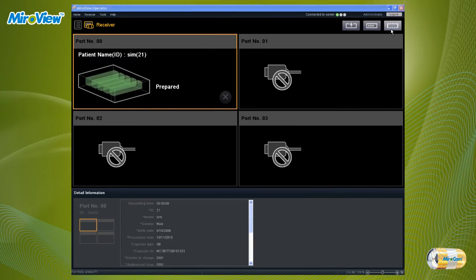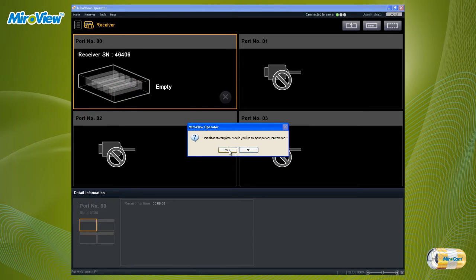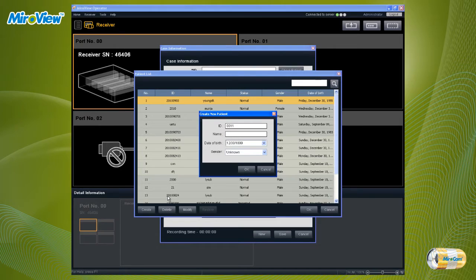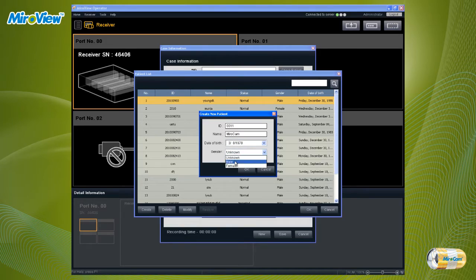After clicking the receiver button, click Initialize. Please be aware that if the receiver is initialized, patient information and data will be permanently deleted. After initialization, enter the patient data. Complete all required fields — if required fields are not entered, the patient data cannot be saved.